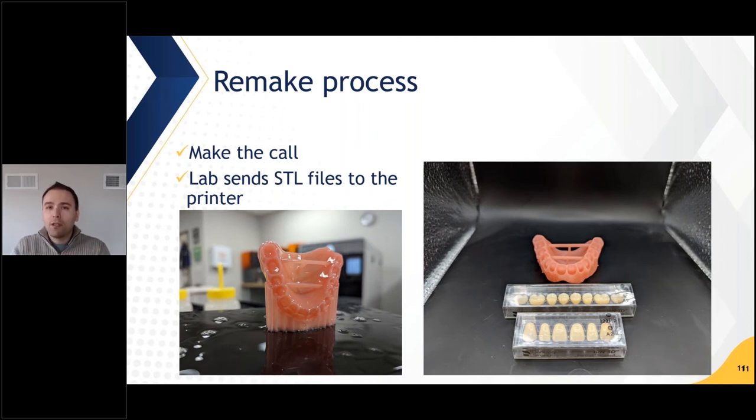And so once we have all that information, if the patient ever loses a denture or needs to replace it or duplicate a backup, we simply pull the old STL before the patient ever shows up at the dentist's office. He just needs to say that he needs it. We will have the denture printed and the teeth glued in and finished within a day, and have it delivered at the dentist's office before the patient even shows. And because this denture has already been verified in the patient's mouth, there's going to be very little chair time at the dentist's office. So this is one of the smoothest processes I've ever seen for remakes.